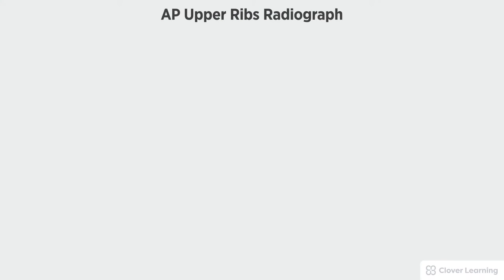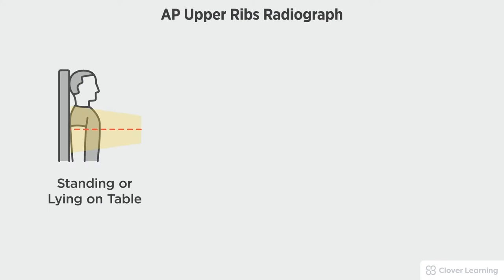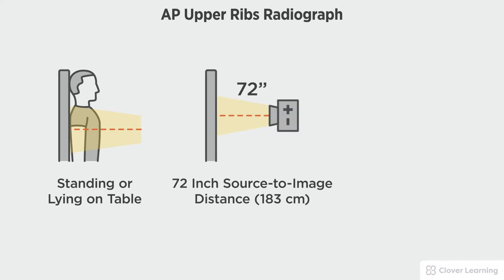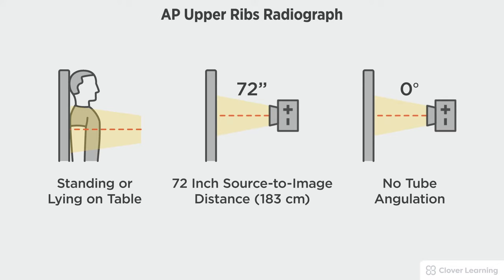In this view we will be demonstrating the AP upper ribs. The AP ribs above the diaphragm should be performed with the patient standing at the upright bucky or lying on a table, with a 72-inch source to image distance and no tube angulation.